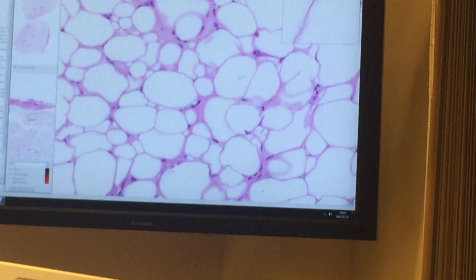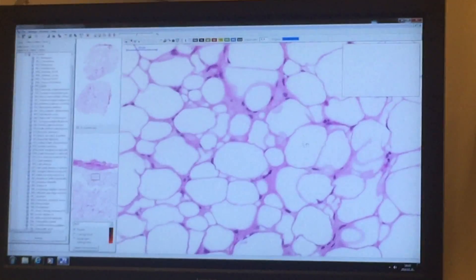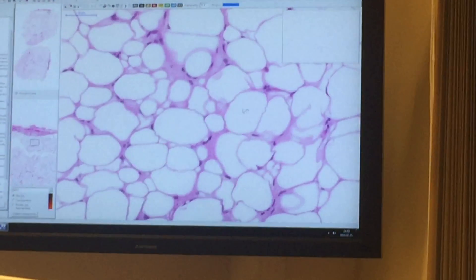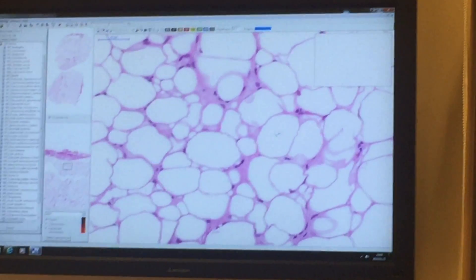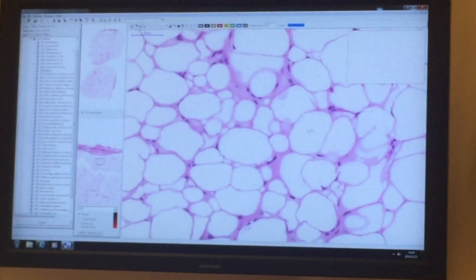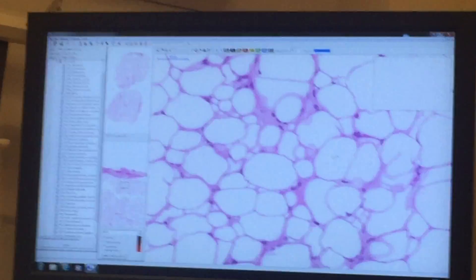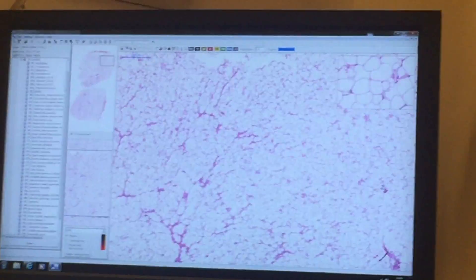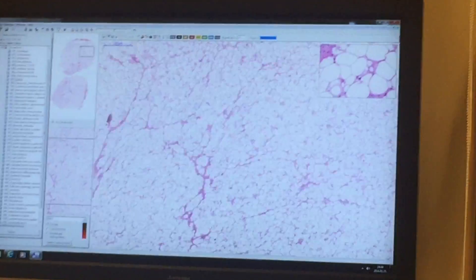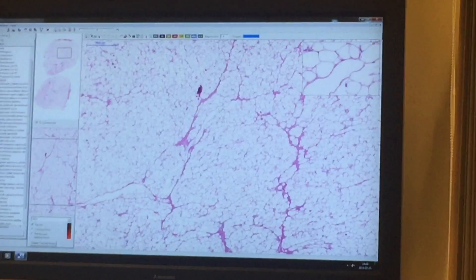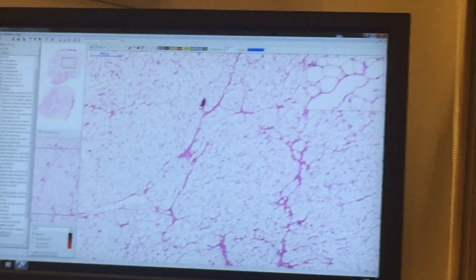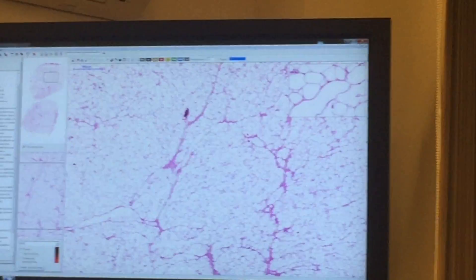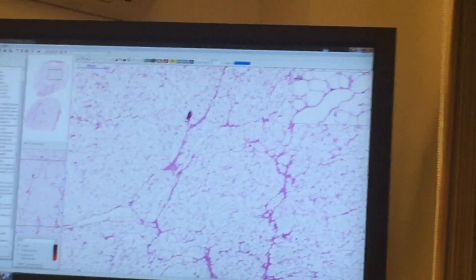If we go closer, we will see typical normal fat cells — nuclei next to the membrane, the cytoplasm will look empty, it's clear. And sometimes through the tumor or through this mass, we will see connective tissue fiber septa, which are dividing the cells.